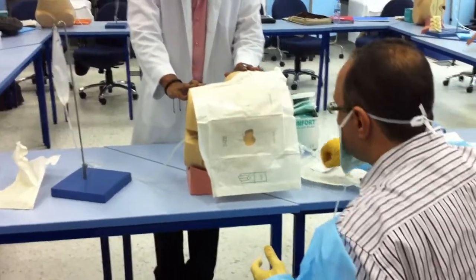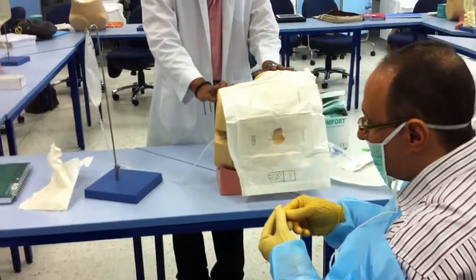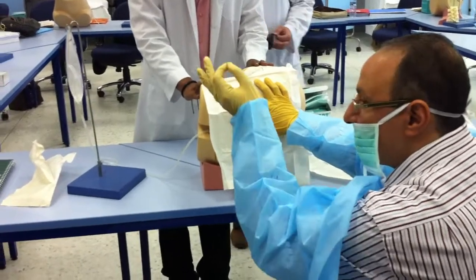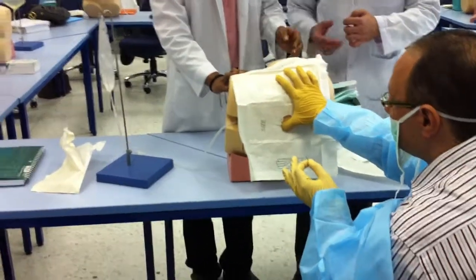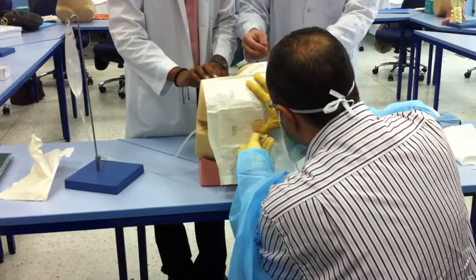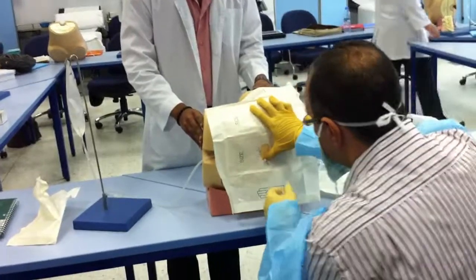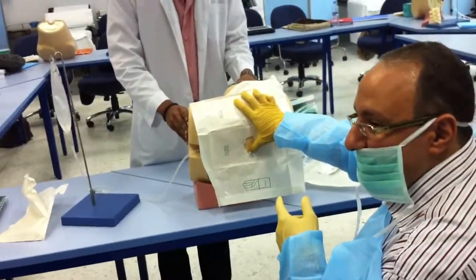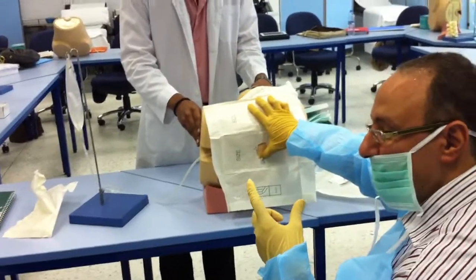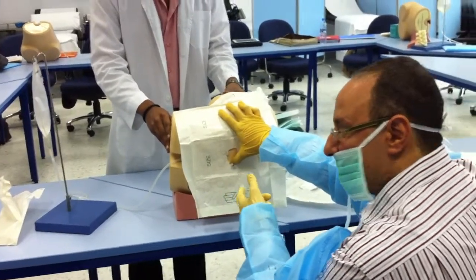We're going to give a local anesthetic with a syringe and a small needle, subcutaneously only. Then I'm going to enter with an introducer. The direction of entry — is it completely vertical or slightly angled toward the head? Slightly angled toward the head. This needle is made so you'll never accidentally reach the subarachnoid space, because the spinal needle will encounter the CSF at around four to five centimeters, and this introducer is shorter.